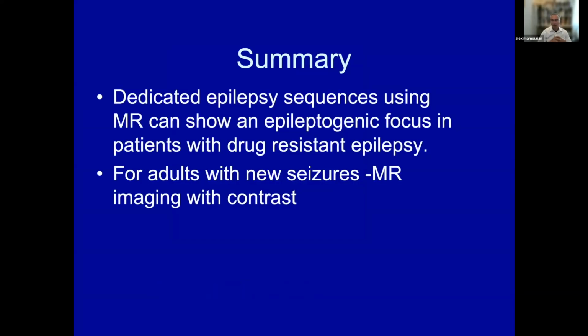So that's all the material I'm going to show you today. I know I covered a lot. I want you to be conscious then of the fact that you need dedicated epilepsy sequences to allow you to identify an epileptogenic focus in patients with drug-resistant epilepsy. Remember that your approach to imaging is going to be different depending on the timing of the onset of the seizures and what you suspect as a cause of the seizures.